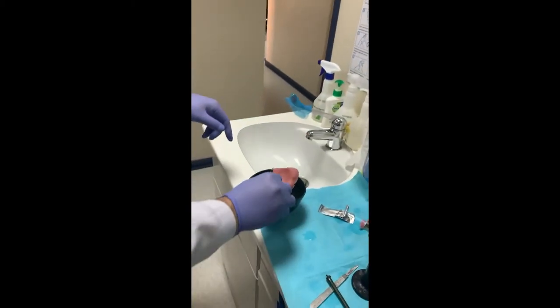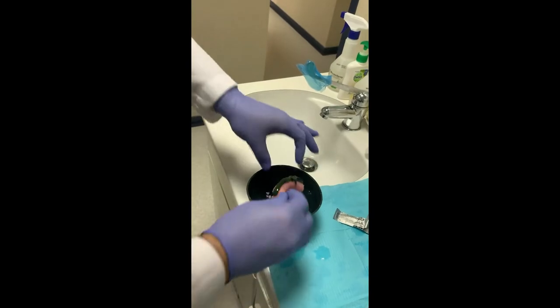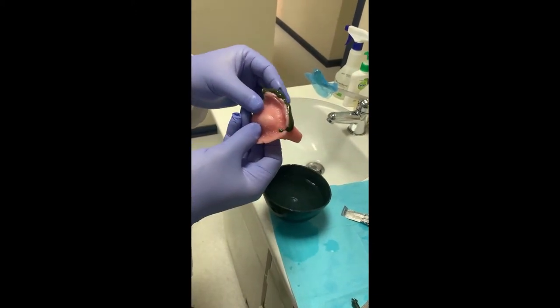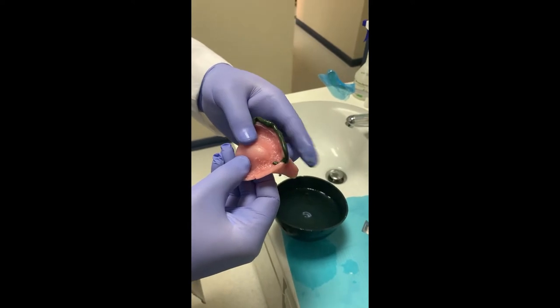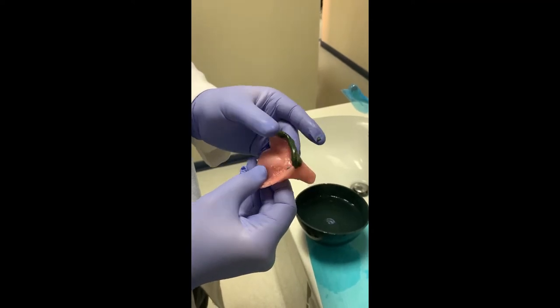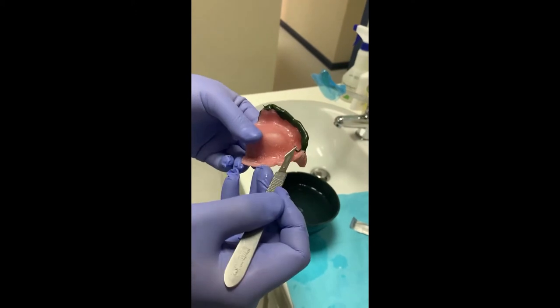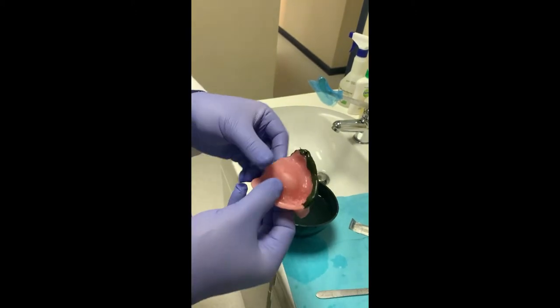Put it inside the hot water and wet your hands — it is too soft. Drive the material towards the edge of the flange, making it rounded on the edge. If you end up with some material onto the fitting surface of the tray, just remove it; don't allow it to stay there for making the impression.